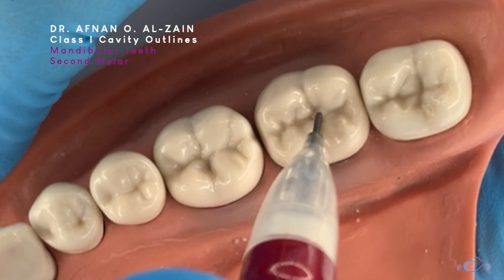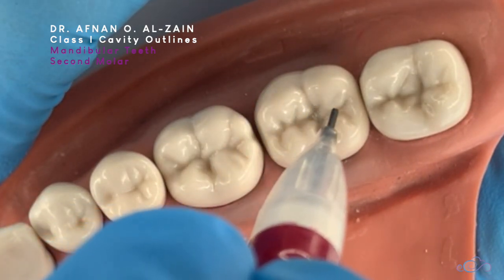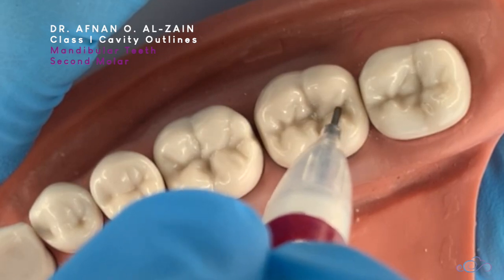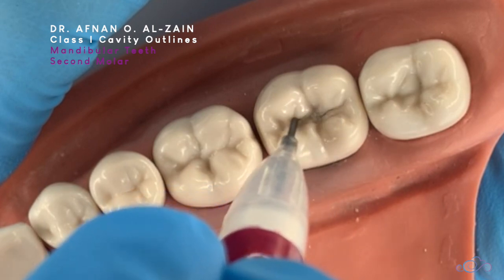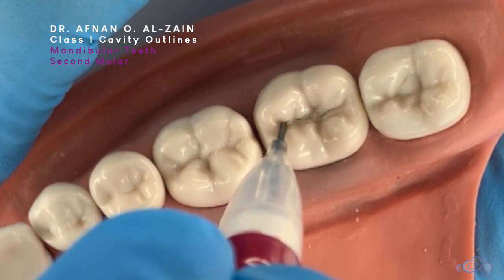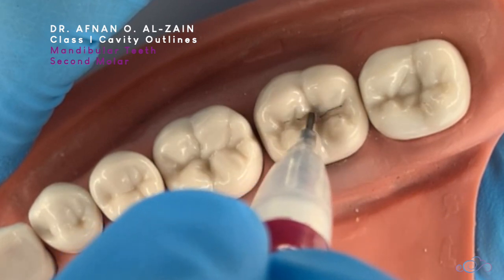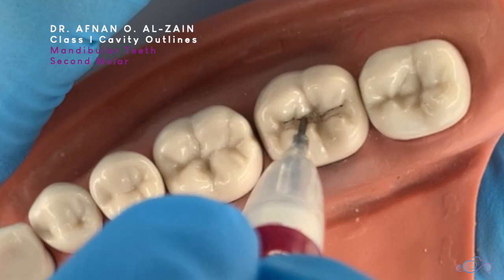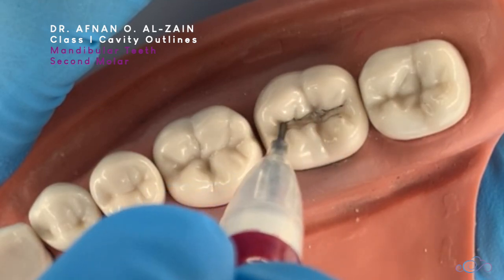You can start from the middle, from the distal, or from the mesial to draw the outline — it doesn't matter, but we're going to start here from the distal. So we're going to start from one triangular fossa, go through the central groove to the other triangular fossa. It's going to be approximately a straight line, going from one triangular fossa to the other triangular fossa on the other side.